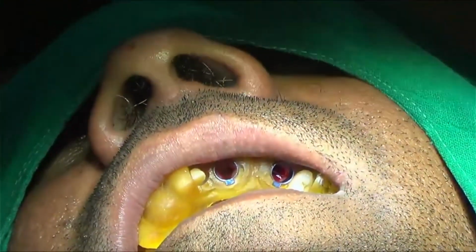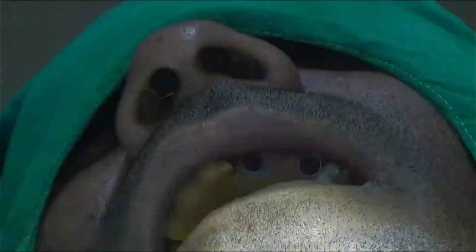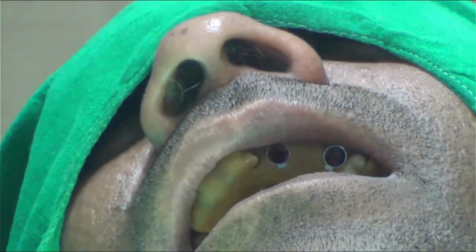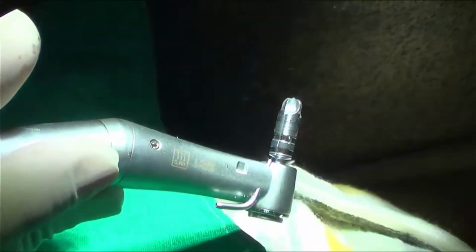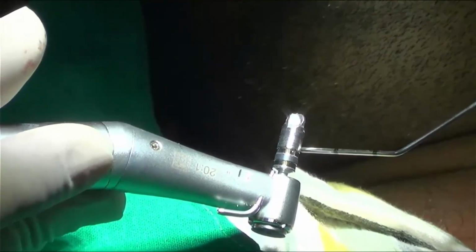So next is a bone flattening drill. There is something called an offset value. Here in the pictorial representation, you can see that I have to take the bone flattening drill till the bottom of the first black mark. So this is my bone flattening drill, and I am going to take it till the bottom of the first black mark as indicated in my diagrammatic representation of the drilling protocol.